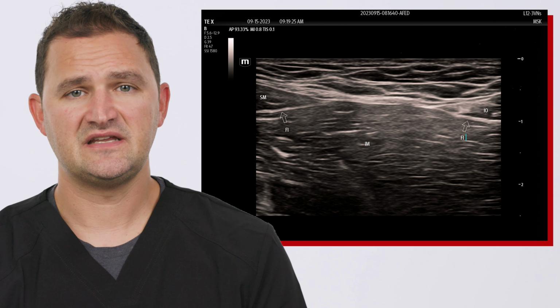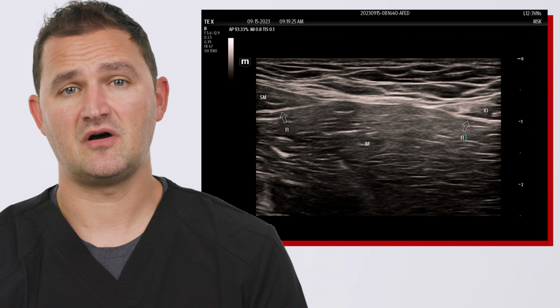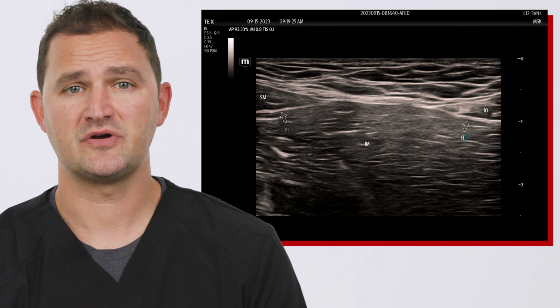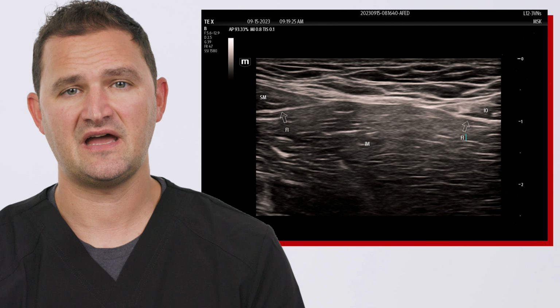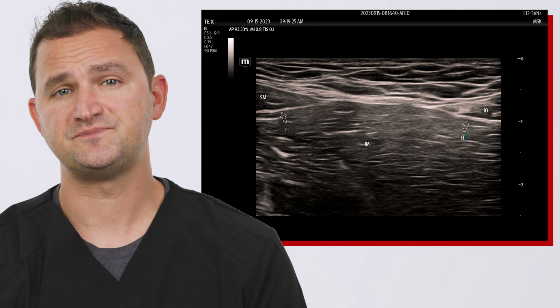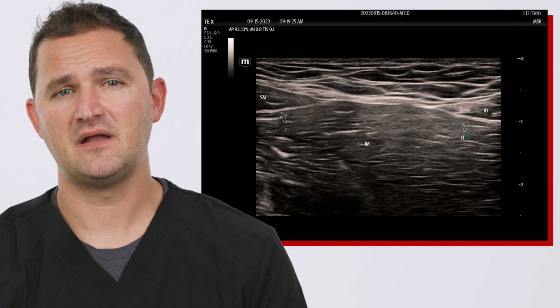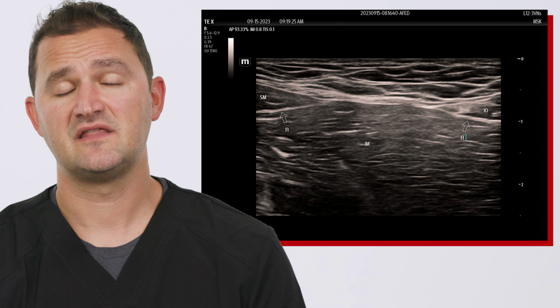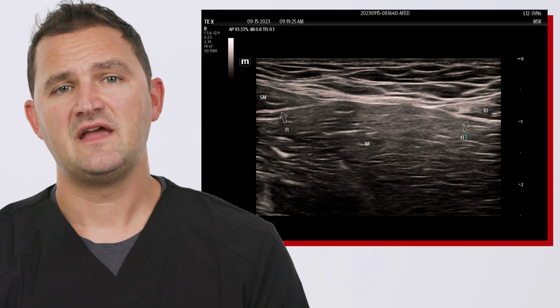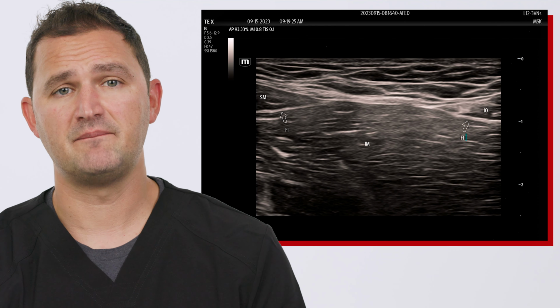This technique is also known as the bow tie technique, where the bows are the two muscles, either the sartorius or the internal oblique, and the tie in the middle is that fascia combination, which is actually the inguinal ligament. Local anesthetic is spread underneath the fascia, but on top of the muscle, in this case, the iliacus muscle. If you do this technique, you're pushing the local anesthetic cephalad, or up towards the umbilicus.